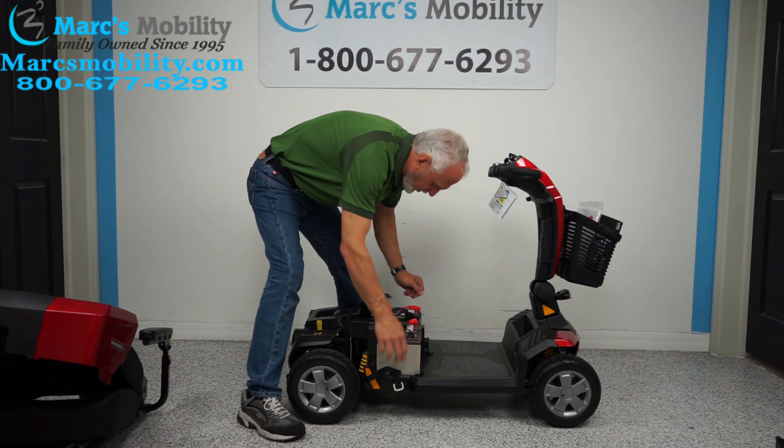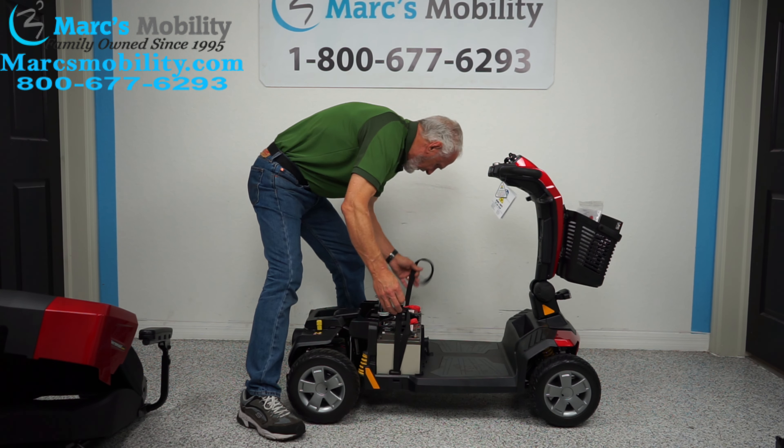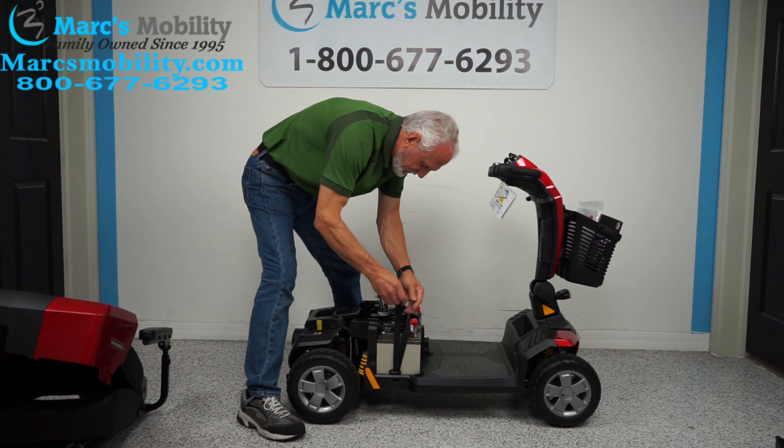You've got the batteries back in. Take your strap that you pulled towards the back, put it back on top, and just strap it back together like this. Then take your cover, put your cover back on, and it'll snap right here.